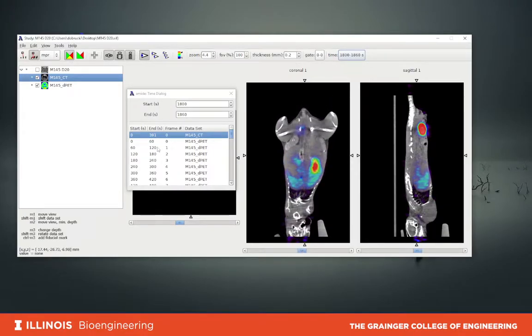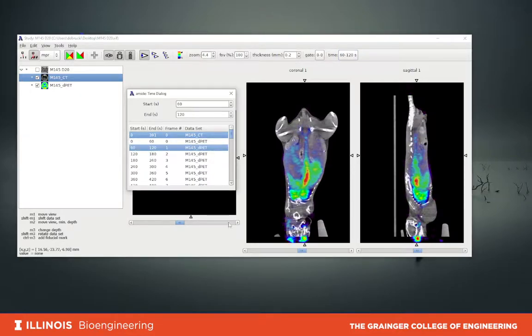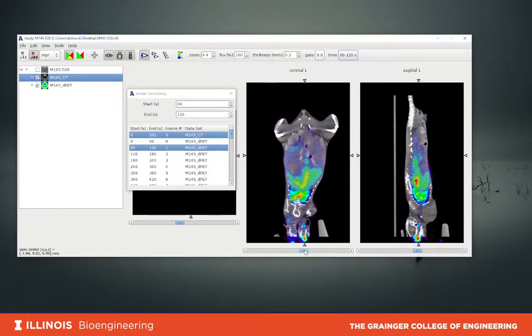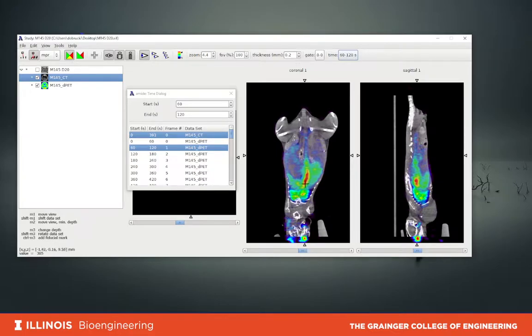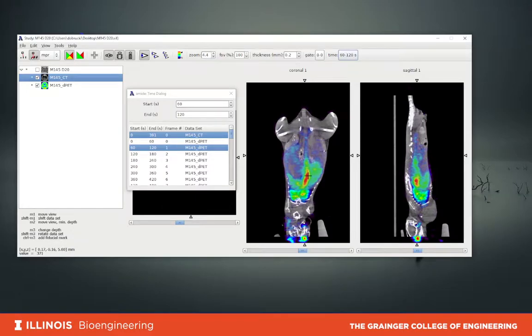Especially during the first few minutes — let me change to the second frame — you can also see that there are some vessels. This is a very high activity vessel which pumps blood to the rest of the body, most probably the abdominal aorta. Selecting a region of interest on any of those three organs — the abdominal aorta, the heart, or the lung — should give you information about blood clearance, or how quickly the radiotracer is being cleared from the blood.